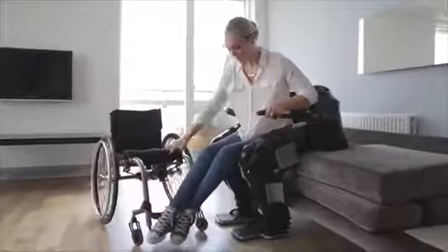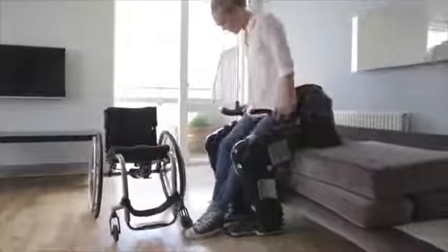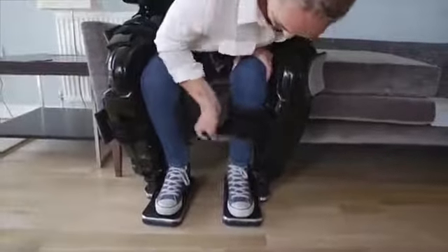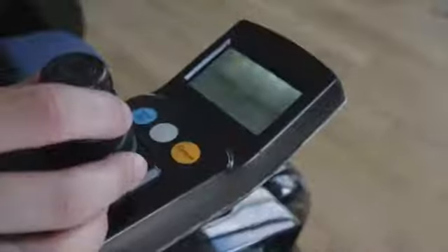Once I'm in and seated as far back as possible, I then fasten the straps around my shins and thighs until they're secure, but not too tight to avoid too much pressure. Also, the pads are soft and flexible and can be detached and washed. I transfer using this method, but everybody is different. It is possible to use a hoist or assistance to transfer.